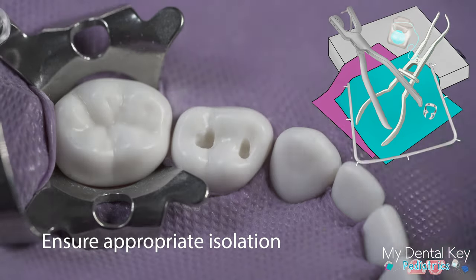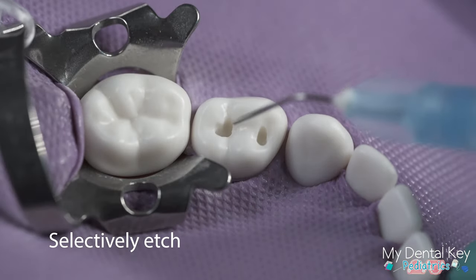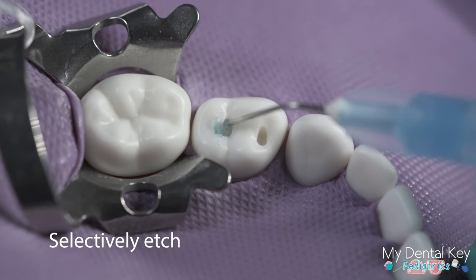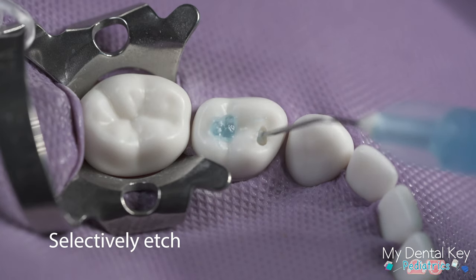Ensure that you have proper isolation of the prepared tooth with your rubber dam. Apply etch to the preparation, starting with the enamel and extending the etch onto the dentin. Leave it for 15 to 20 seconds according to the manufacturer's instructions.